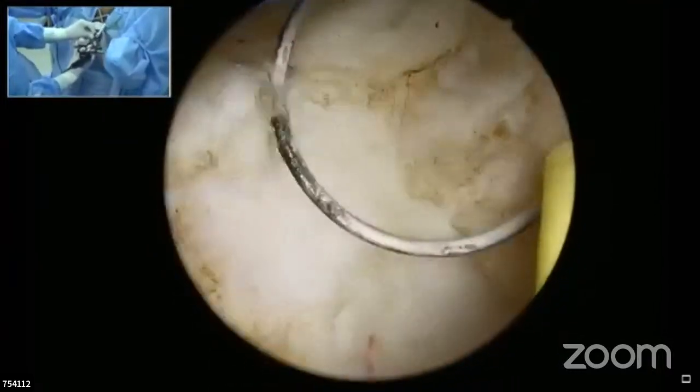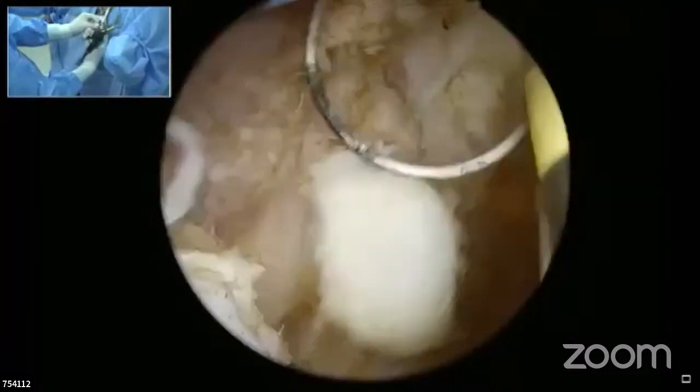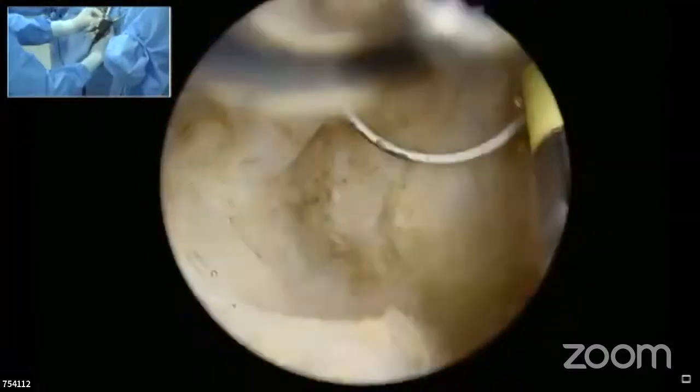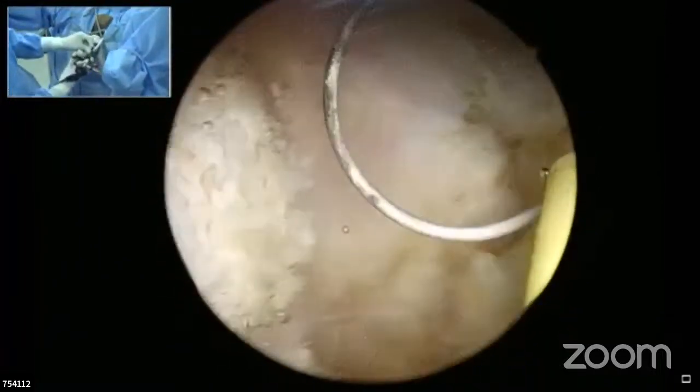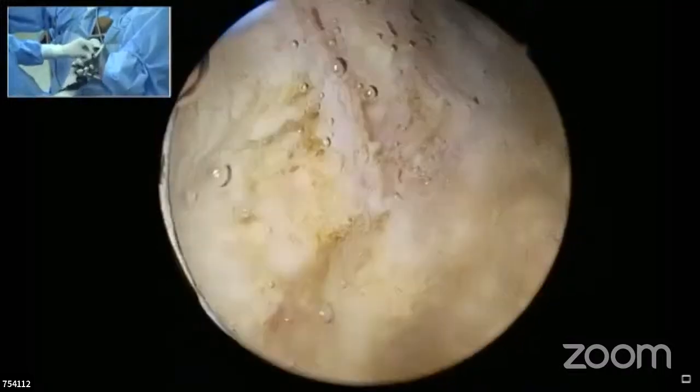When you are doing this large gland and you start cutting, you see the anatomy and you will recognize you are going close to the capsule. So in the first 2-3 bites, you are not going to open the capsule at all, actually.